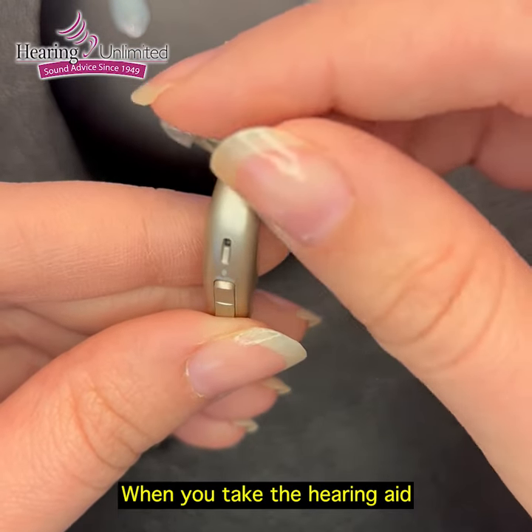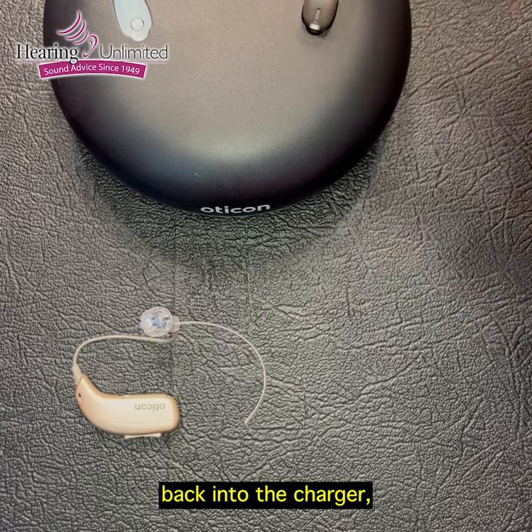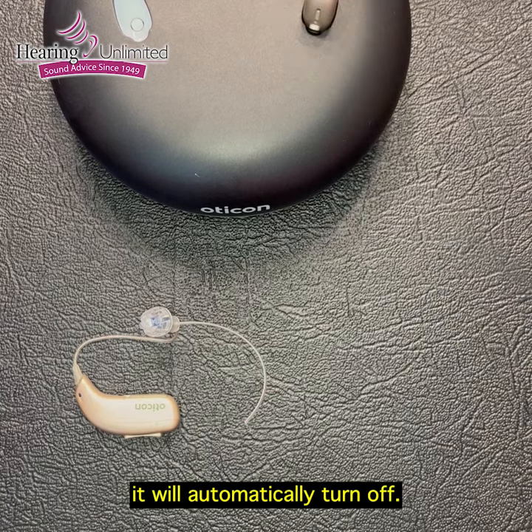When you take the hearing aid and you place it back into the charger, it will automatically turn off.